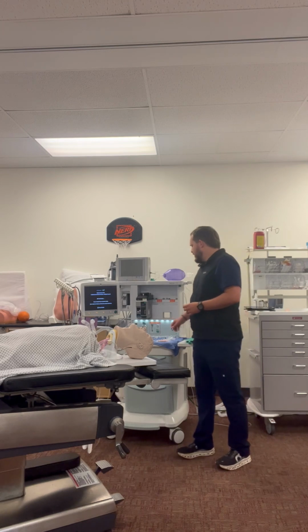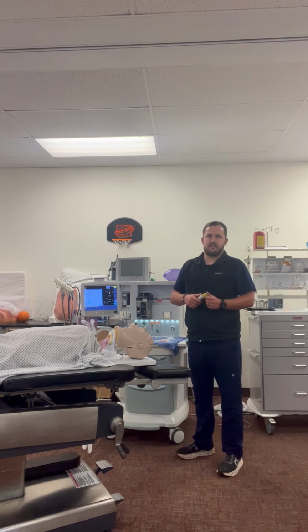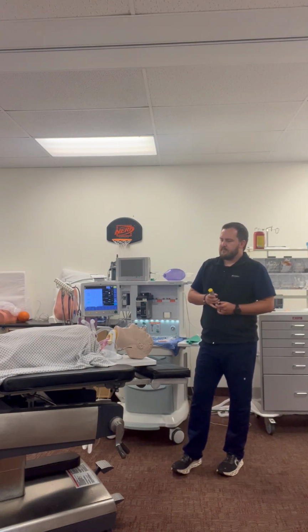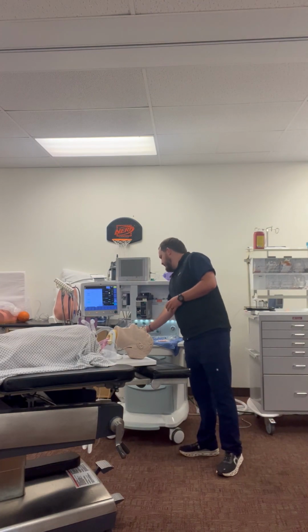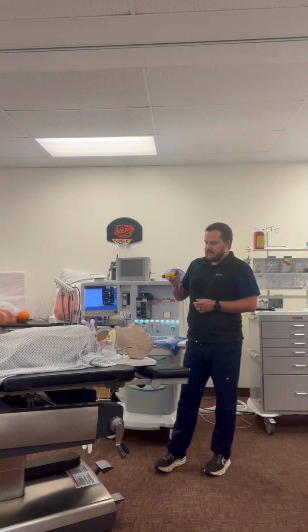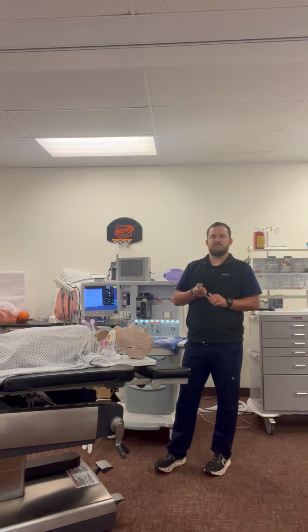I'm going to have a MAC 2 blade ready, and with the MAC blade, it's going to be inserted into the vallecula. At that point, it will open up the epiglottis and allow me to visualize the cords through indirect lifting of the epiglottis. I will also have a Miller blade just in case. With the Miller blade, it is a straight blade. It's going to actually insert over the epiglottis. Oh, sorry, Miller blade.